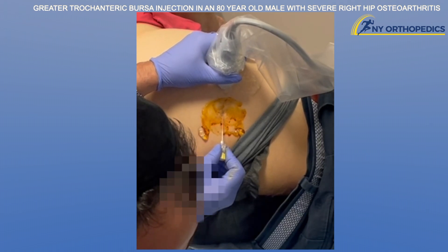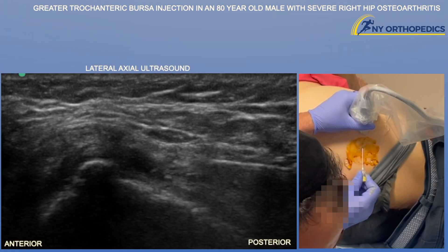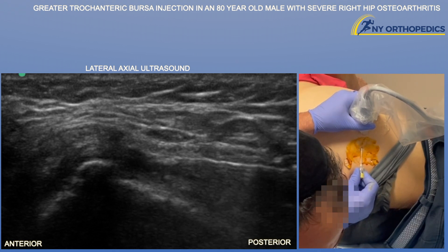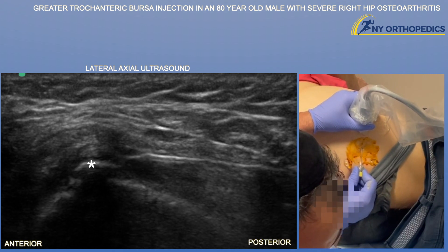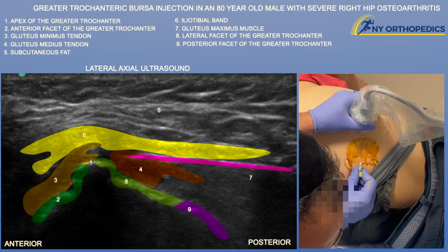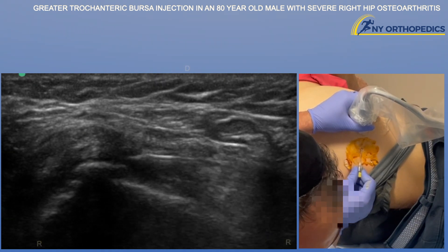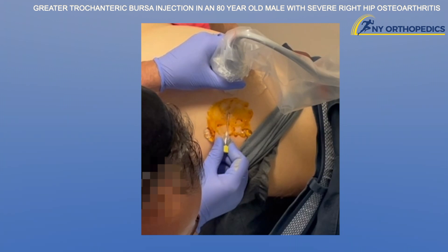We're using a 20 gauge, three and a half inch spinal needle, keeping the stylet in the needle so it will cut through the tissue better. Here we can see nicely that we're heading right towards that apex, trying to slip the needle under the iliotibial band and over the gluteus medius tendon — that's where the greater trochanter bursa lives. You can see that needle tip essentially just between those two layers.